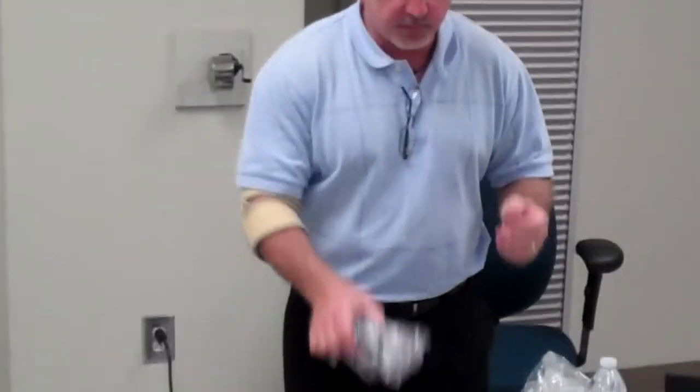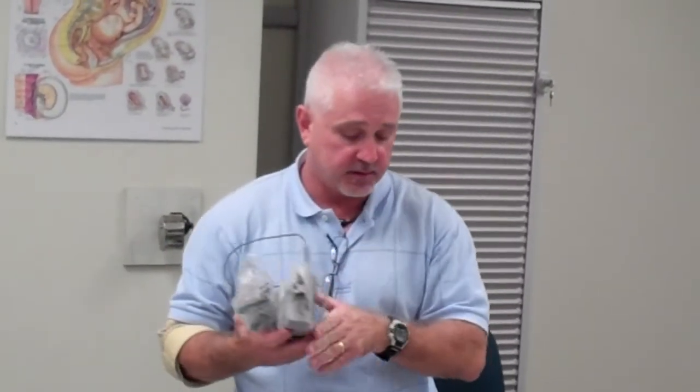Hi, my name is Alan, and I've received a requisition to place a Miss Katie on a 35% simple mask. The first thing I'm going to do is gather my equipment here in the respiratory care department. I'm going to grab a simple mask, O2, a pulse oximeter, and my stethoscope.